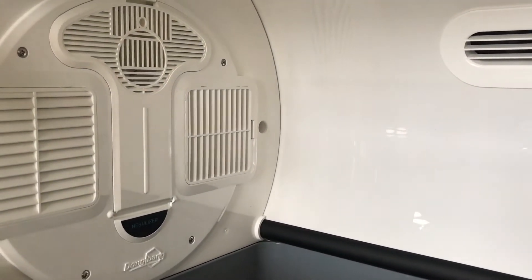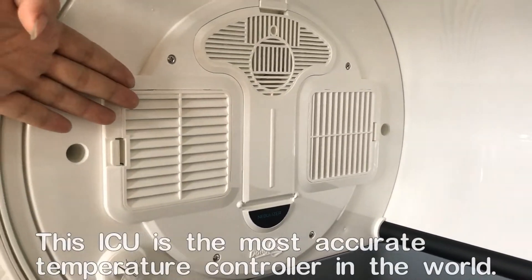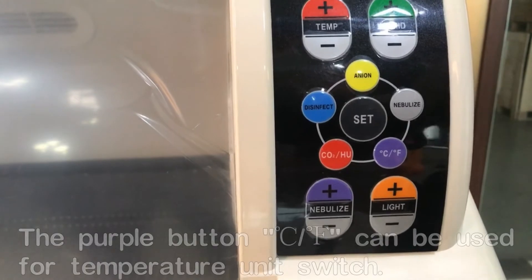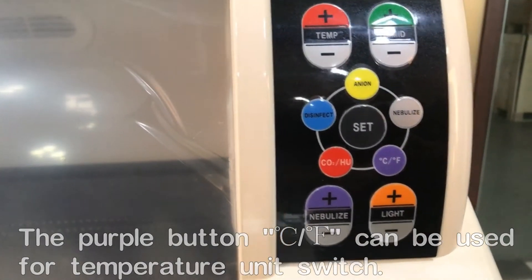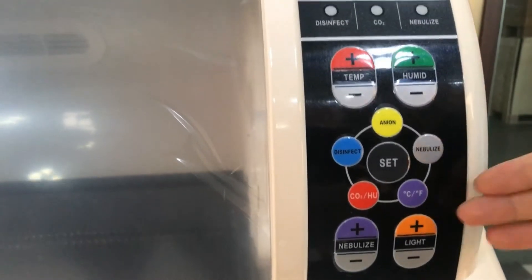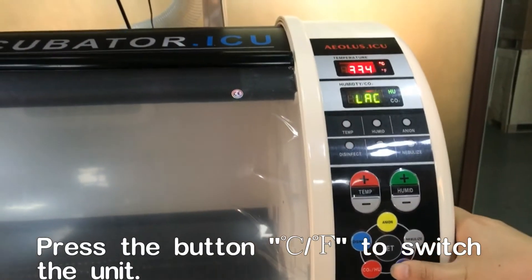We can ensure a 0.8 degree tolerance inside, which is the most accurate temperature control system in this industry. On our control panel we have a switch for Celsius and Fahrenheit degrees. When you press the button you shift between Fahrenheit and Celsius.